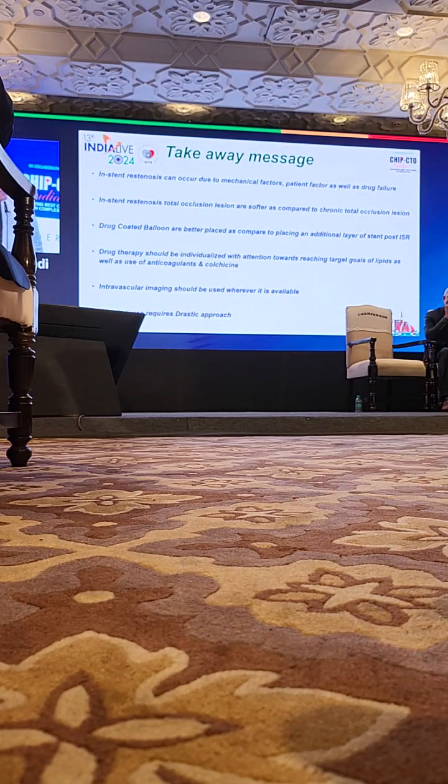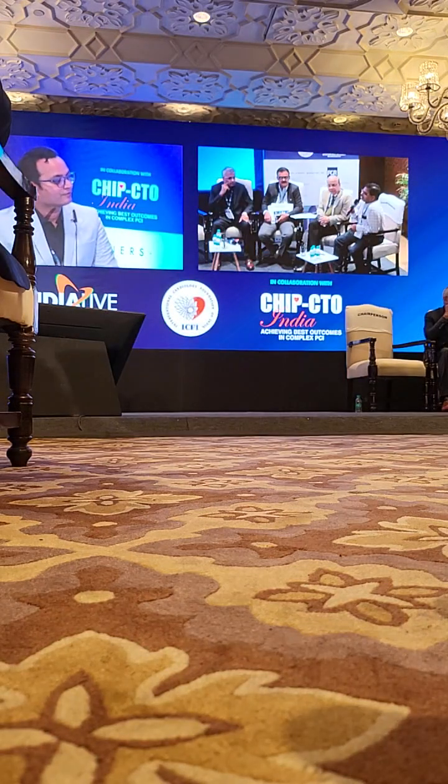Thank you. I want to differ regarding one point. Whenever dealing with repeated episodes of stent failure, intravascular imaging is a must, not wherever available or whenever available. We have to image it like that.